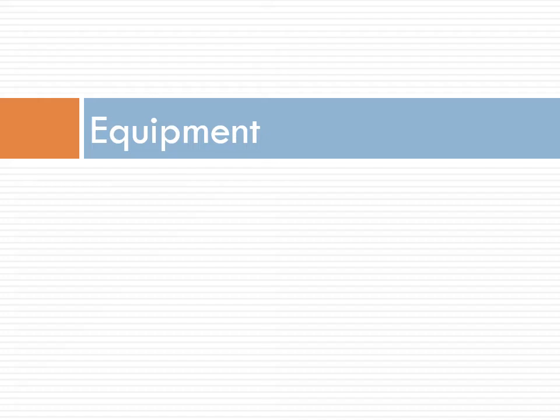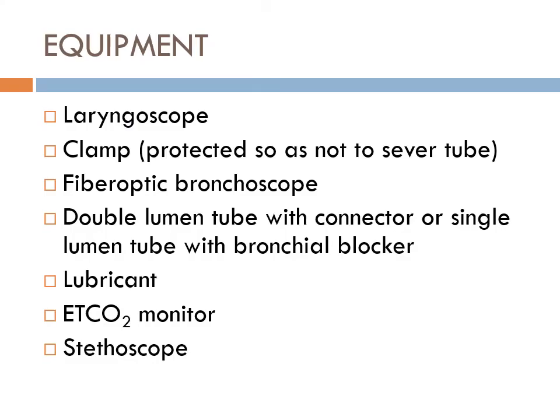Oh, now we're recording. Okay, so you need the laryngoscope. Mac blade's better. Glidescope's the best. The Glidescope is going to be thicker, so when you put it in, you're going to have less room to get the tube in though. So, you know, there's a trade-off there.